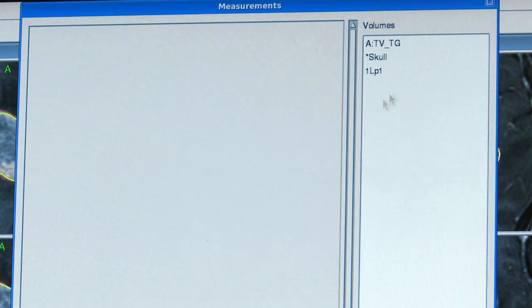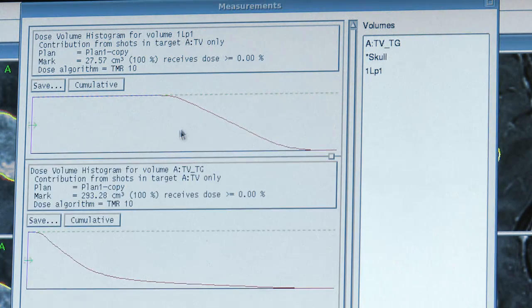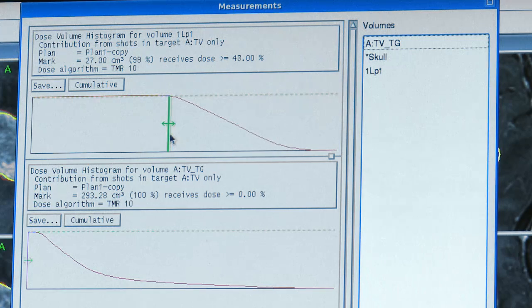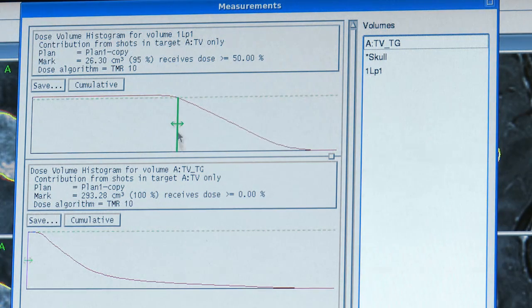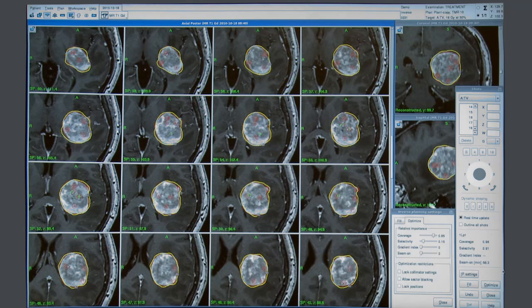And I think we have achieved a very conformal plan here, to confirm the coverage of the target and the conformity. And here we have the treatment plan finished.